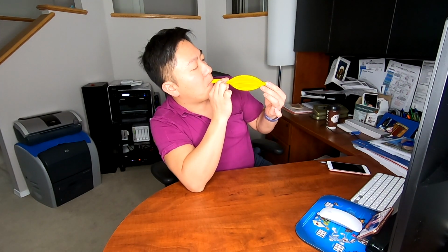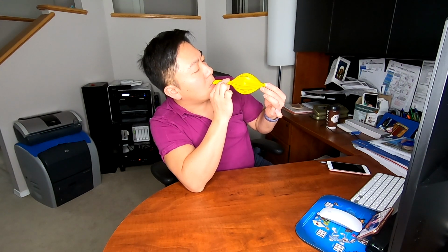Now with CPAP, it's a real simple approach to treating it. An Australian doctor figured that they could apply a small amount of pressure into your body, airway pressure, so that it inflates or stents open your airways so that there's no restriction in breathing, like this. And then as you breathe, the airway can still remain flexible, but air can move in and out of your body without any restriction. Fairly straightforward. Which then leads me to the actual CPAP machine itself.